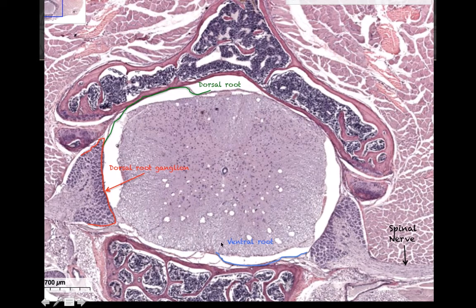Okay, and then on the bottom, if this is muscle control, what do you think the ventral root controls? Yeah, motor output. So these cell bodies actually send an action potential to the ventral root, and the ventral root is all an axon, and it sends it all the way down to send out its motor output to an effector. So this right here is the ventral root on the bottom, and it does not have a ganglion, okay? So it does not touch that dorsal root ganglion. It goes all the way right here, and on this side it goes all the way right here. And this is the dorsal root ganglion, only connected to the dorsal root right here.